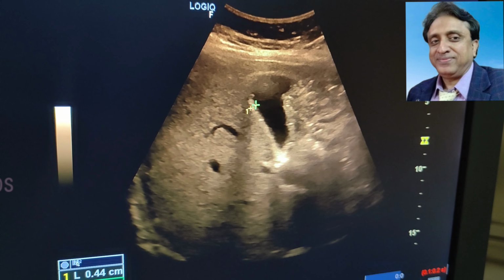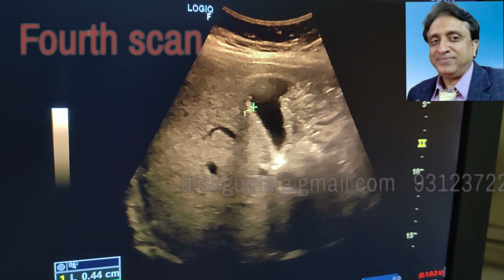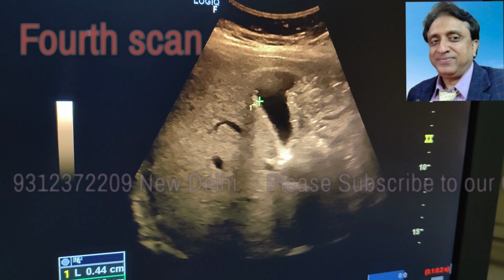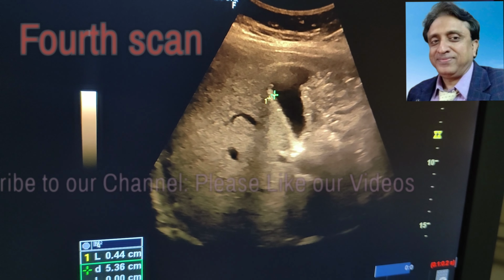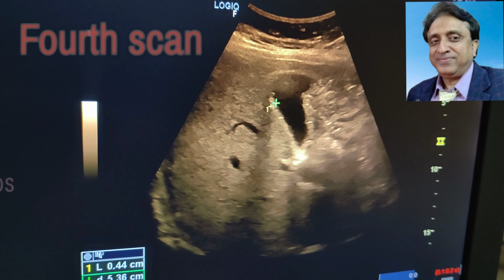This is the gallbladder of the patient around 7 days after the first scan, and you can see that the GB wall edema has nearly subsided. The GB wall thickness is 0.44 centimeters or 4.4 millimeters. Normal wall thickness is less than 3 millimeters, so this is also going to get absorbed with time.